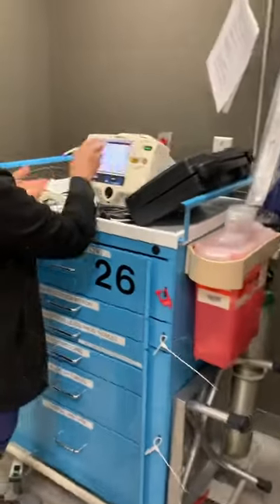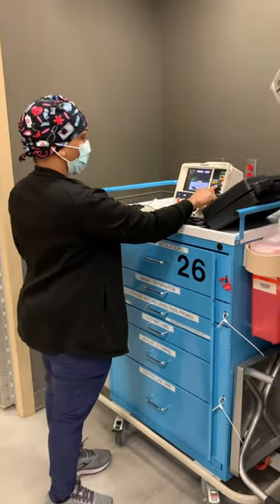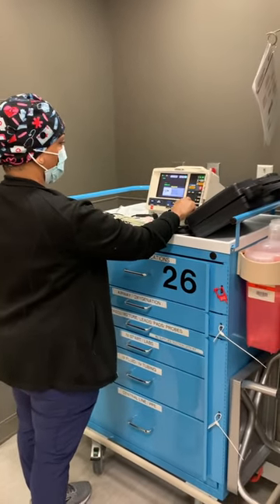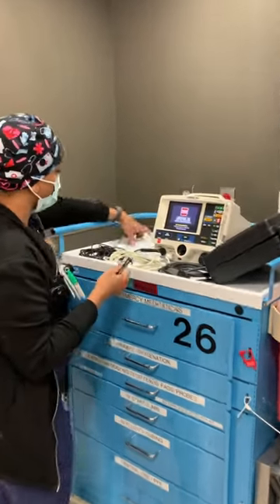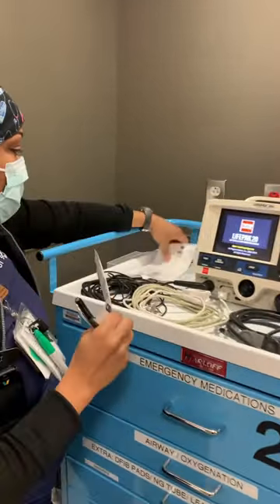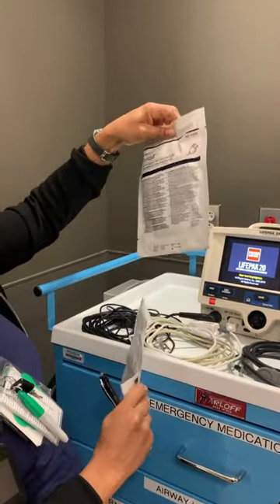Come check the crash cart with me. The first thing I do is unplug the crash cart to make sure that it can run without a power source. Then I'm checking my AED here to make sure that it is running properly by checking a user test. Then I check to see if I have my electrodes, my pulse ox, and my DFID pads and that they are not expired.